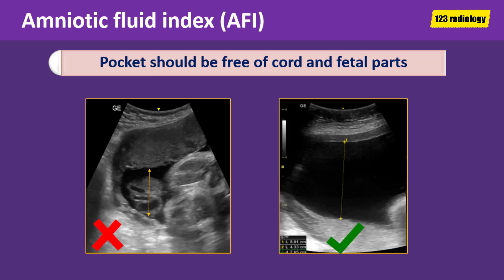There are some pitfalls you should avoid during amniotic fluid index measurement. The first one is to ensure you measure an amniotic fluid pocket that is free of umbilical cord and fetal parts. On the image on the right side of the screen, the measurement is incorrect because the pocket contains a loop of the umbilical cord. On the image on the left side of the screen, the measurement is correct because the pocket is free of cord and fetal parts.